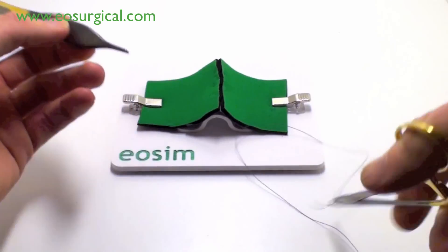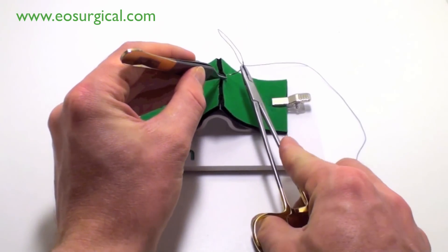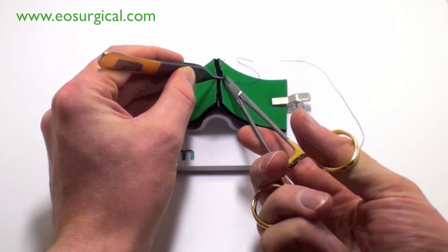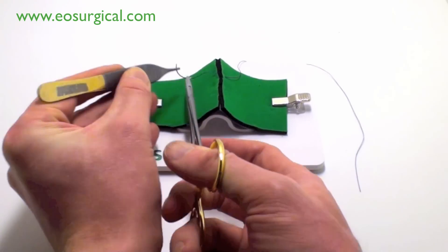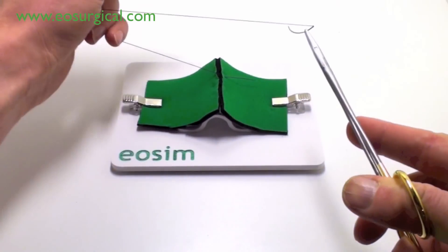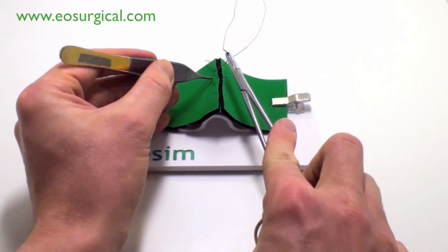Now, let's look at this from a more expanded point of view. This will show you what the surgeon's hands are doing. Again, note how the wrist is rotating to allow the suture and needle to curve through the tissues.